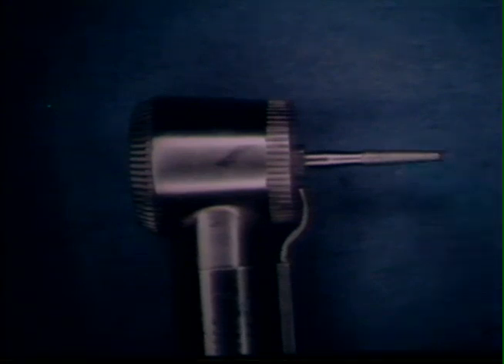This is the armamentarium we will be using today. This is a 1½ DT diamond burr. This is the chrome steel crown that we will be placing in the clinic onto this preparation. We will not be doing this in the lab — we will only be cutting the preparation.